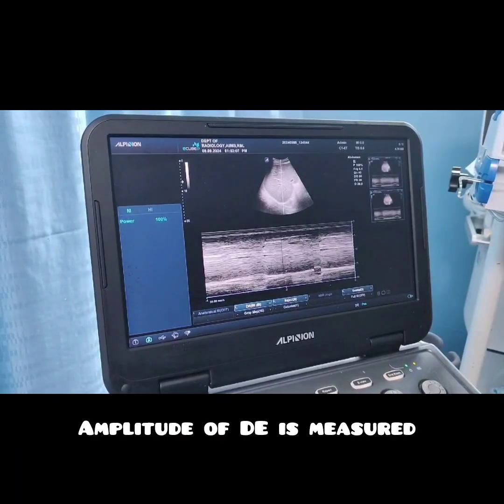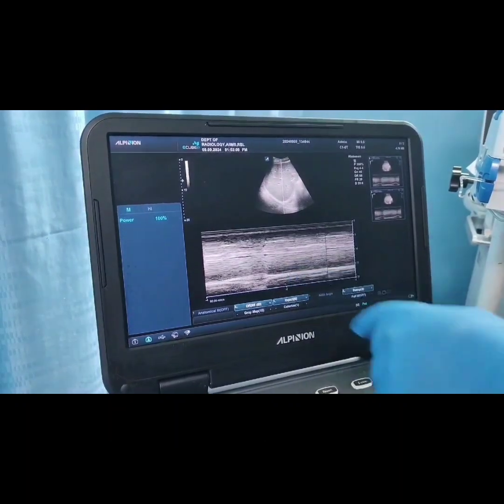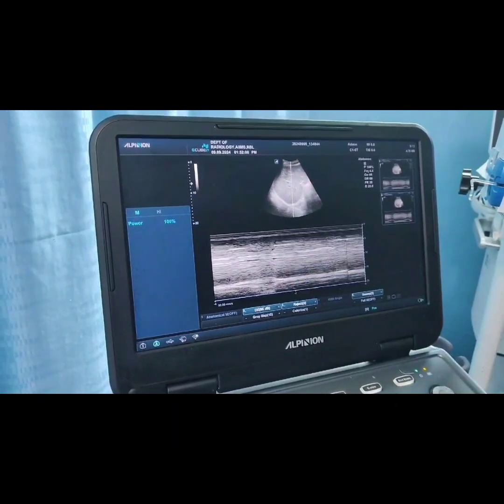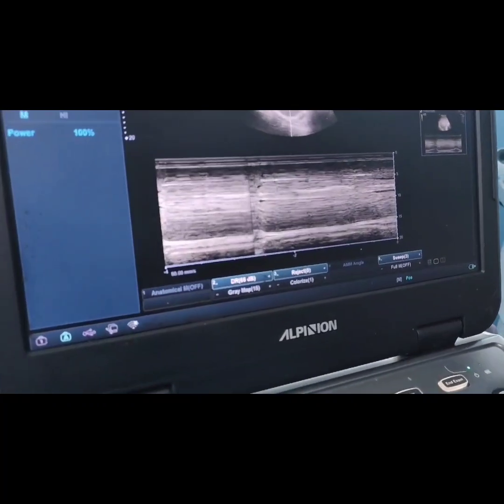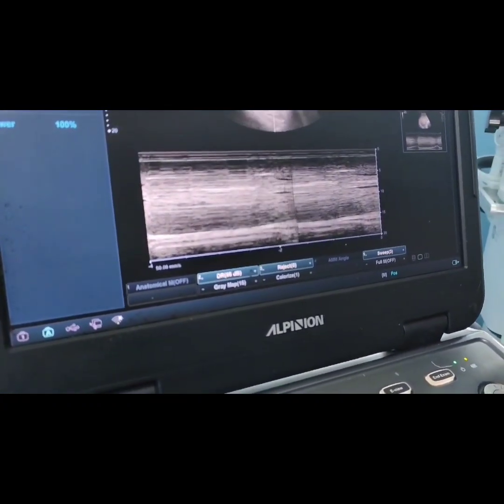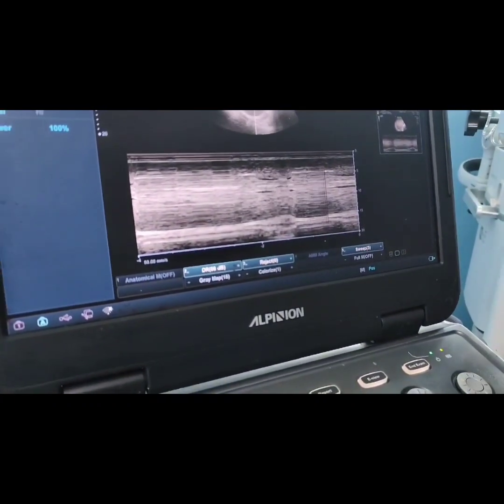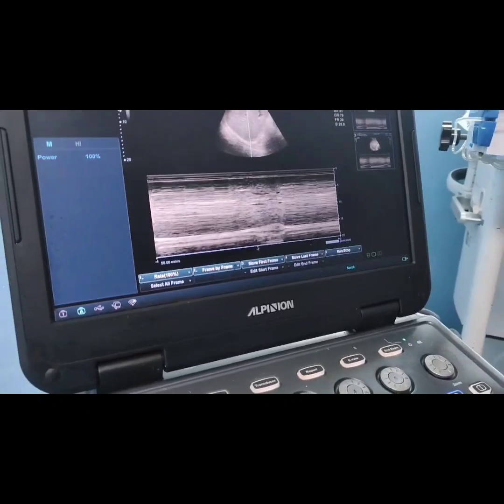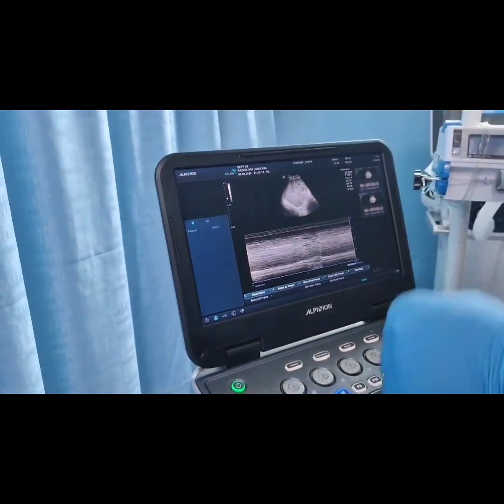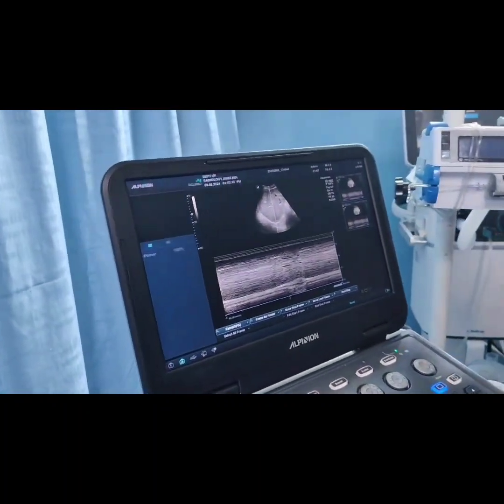We can see there is a peak of the hemidiaphragm. This peak occurs during inspiration and represents the amplitude of motion of the diaphragm during inspiration. We have to measure this amplitude from the base of the peak.